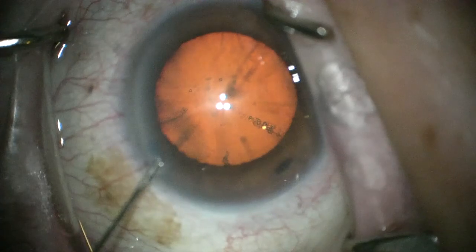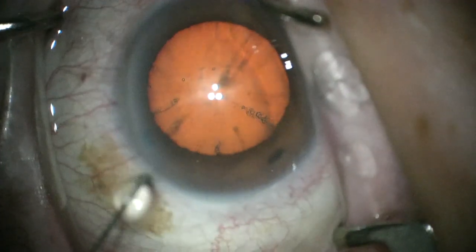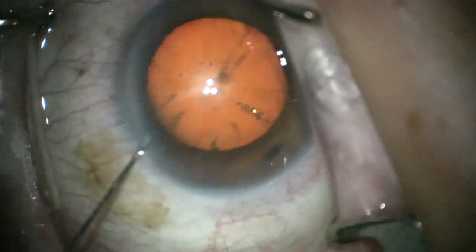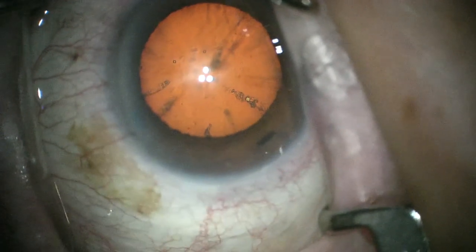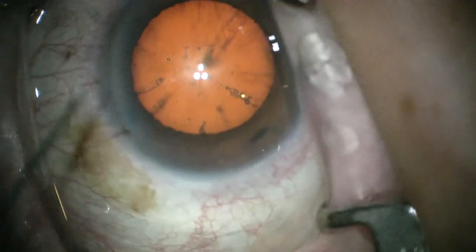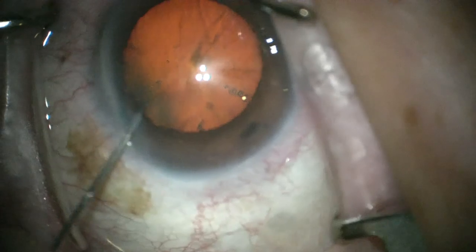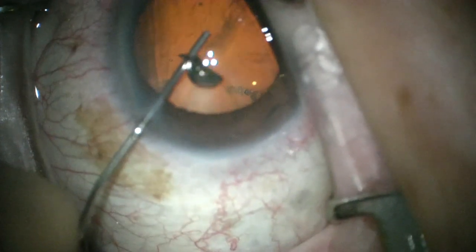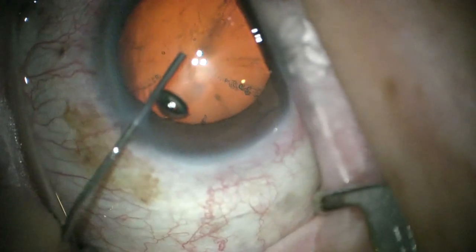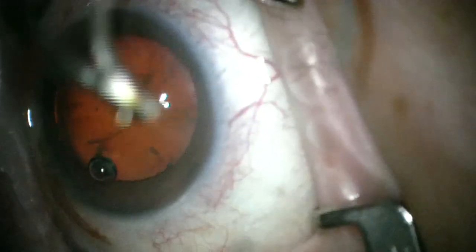You can see there's a lot of twitching of this eye under topical anesthesia. Sometimes we have to be patient until the patient settles down a little bit and be careful. You can see I wouldn't want to do capsulorhexis without stabilizing this eye, and sometimes you have to stabilize it for more than just the capsulorhexis. You can see I did stabilize it for the paracentesis, which I always do anyway.